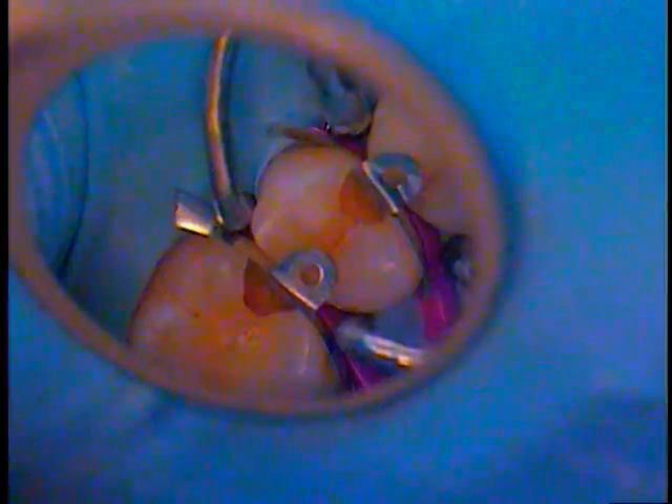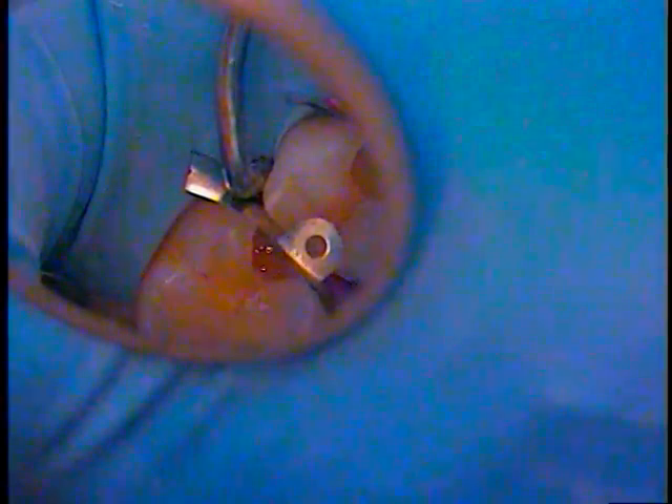I'm going to go ahead and add Vitrebon to number 14, and just put it right there. So we have a 5.0 composite on 14 and a 4.5 on 13. Distal of 13 repaired with Surefell Posterior Flow.